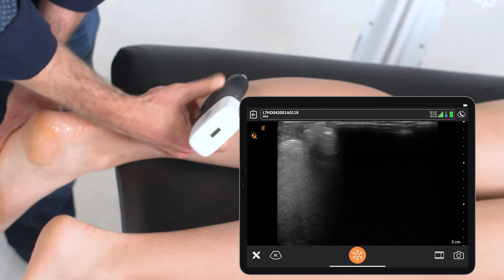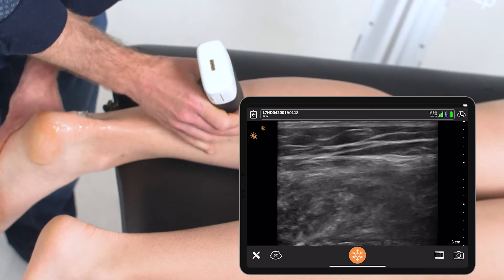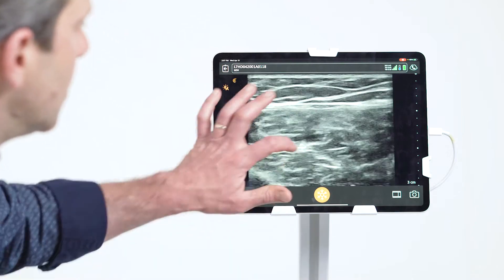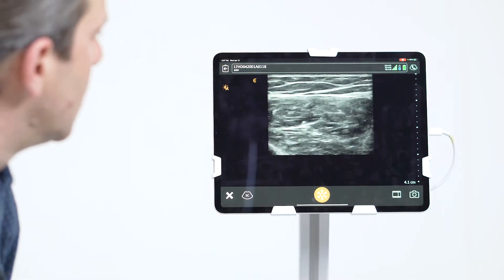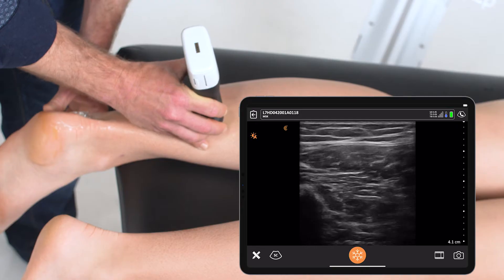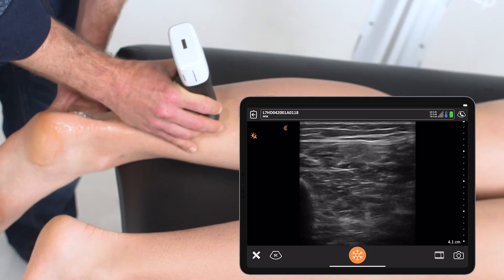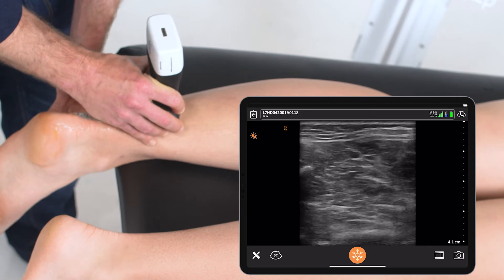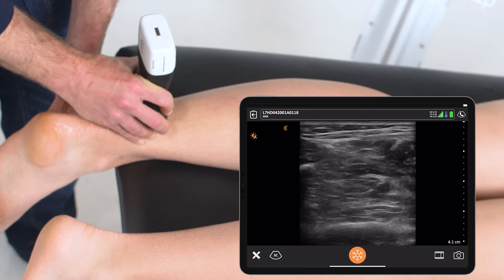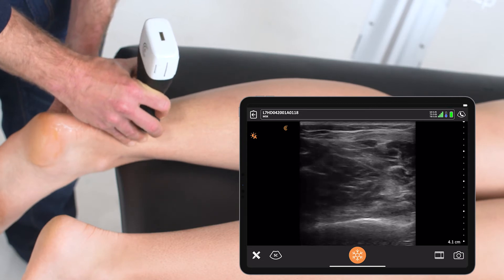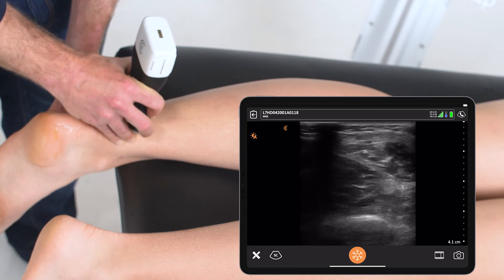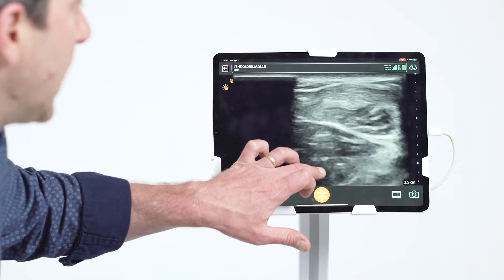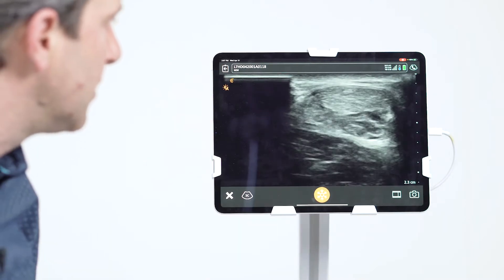A similar scan can be done in transverse, looking at the belly of the gastroc, and then coming back down transverse into the Achilles tendon.